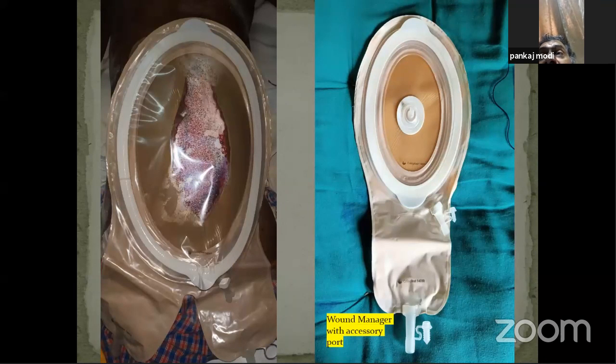So when the fistula is relatively controlled, there is only one proximal opening and one distal opening, or you know that there is nothing beyond this distal opening, you can pass a catheter, Foley catheter, anything, which will go through this port. This is usually useful in proximal fistula, particularly with bile. For distal fistula, the loss through the fistula is less. But in a proximal one, like a jejunal fistula or biliary fistula, we apply the fistula manager, pass a catheter through this port into the distal opening and inflate by 2-3 ml by Foley catheter. So whatever content comes from proximal and is collected here can be put back inside the bowel, which is known as fistuloclysis. You can call it refeeding also.